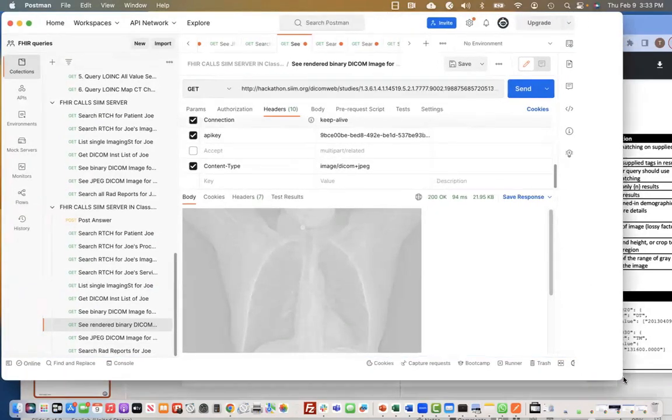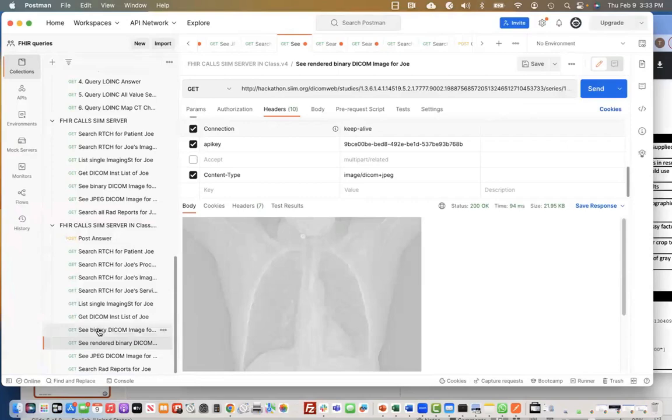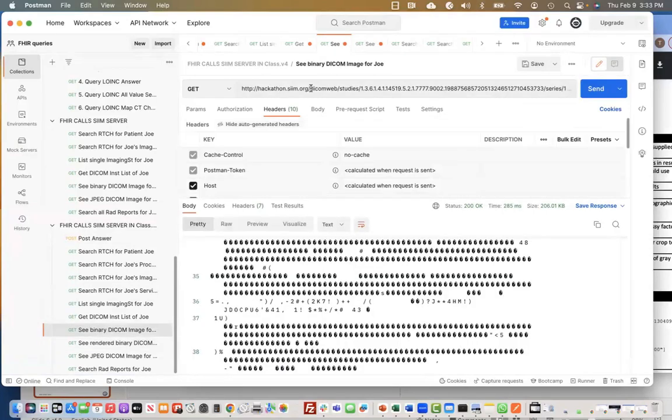So this particular server, I'm going to use what's called the SIIM Hackathon server. Now, for this to work, I need to put in a special key for a very minimal sense of security. It's a special API key, which is free through SIIM. So yet another reason to join SIIM is you can get a hold of the SIIM Hackathon server, which supports DICOMweb.